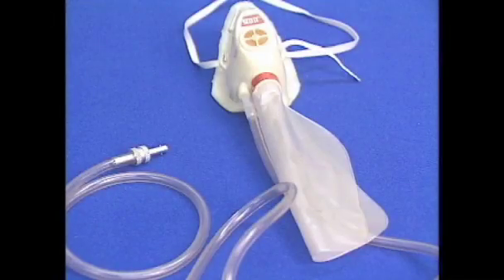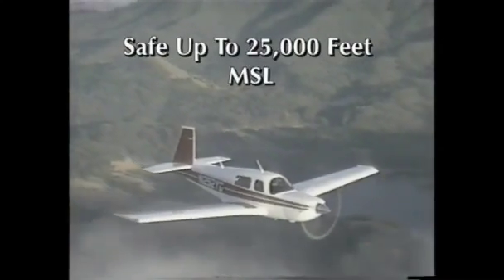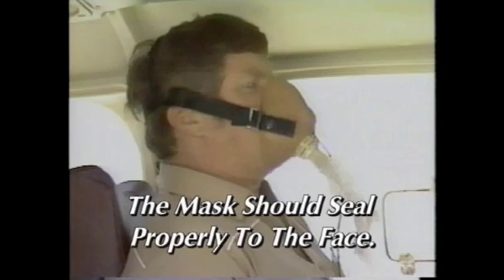It has an external plastic bag that inflates every time you exhale. The purpose of the bag is to store exhaled air so it can be mixed with 100% oxygen from the system. This type of mask supplies adequate oxygen to keep the user physiologically safe up to 25,000 feet mean sea level. The mask should seal properly to the face.